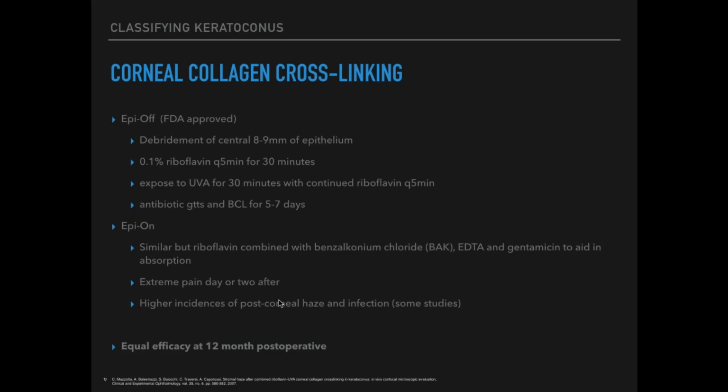There's two forms. There's epi-off and there's epi-on. Epi-off is the current FDA-approved format. This requires debridement of the central 8 to 9 millimeters of epithelium. Co-managing these patients will be a lot like co-managing a PRK patient. The good news is most of the patients we do this procedure on are young and healthy. If you've done a lot of PRK post-op appointments, you know sometimes it can be very difficult to get these patients to re-epithelialize, especially if they're smokers, especially if they're diabetics. If you have a 21-year-old kid who's healthy, he or she is going to be able to re-epithelialize very, very quickly. And so 5 to 7 days typically before you can remove a bandaged contact lens.